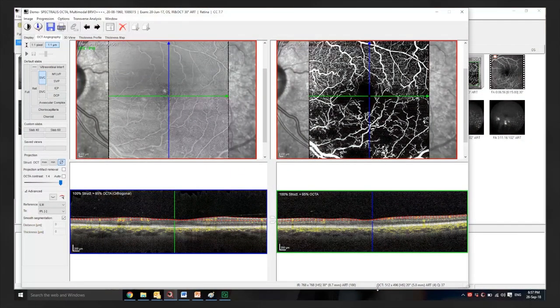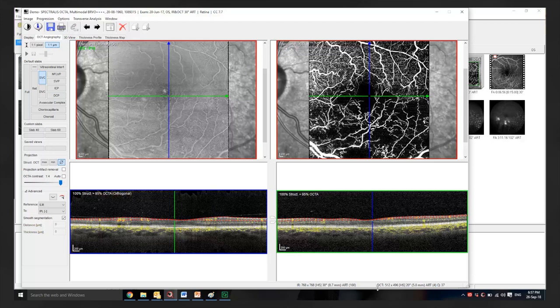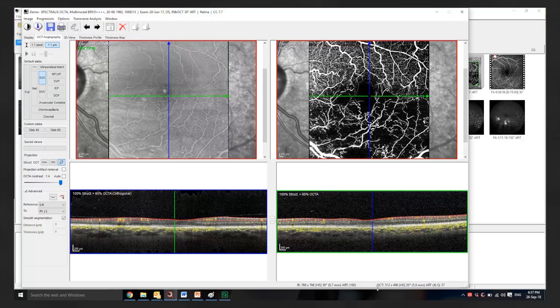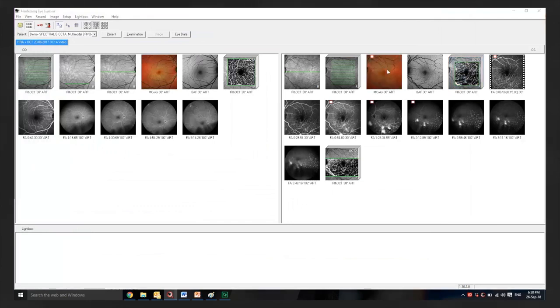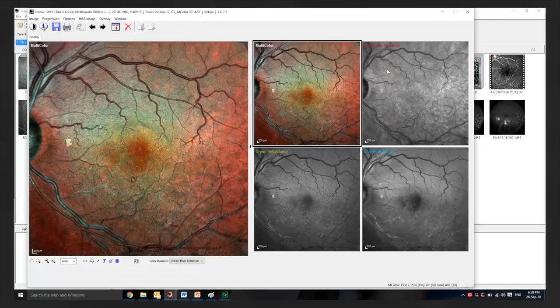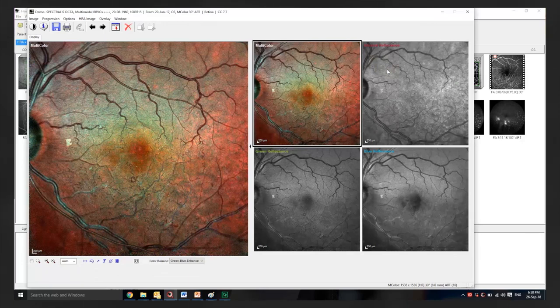Although OCTA angiography gives very nice images it's important to understand that it's giving limited information about flow in the vasculature. It's important to interpret this with other imaging modalities to gain additional information. Color photography would be particularly useful for signs such as exudate and this may give an indication of the chronicity of a disease process. This information would not be gained from OCTA.